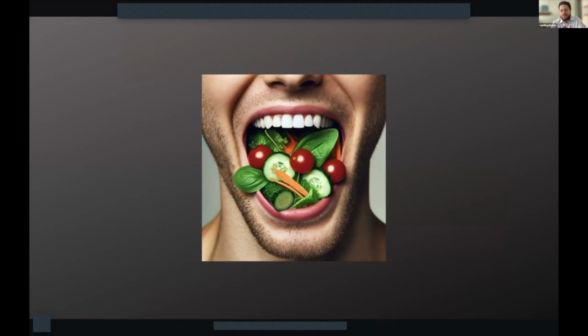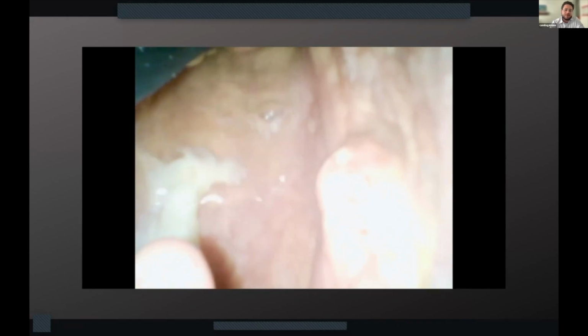So I just mentioned this part. It's just a SALAD technique. I hear a lot about, oh, you can't perform video laryngoscopy on patients that have active emesis or have blood in their oral airway. But this is a good video proving that you can use video laryngoscopy and video assisted laryngoscopy to actually, this is the real viewer warning.